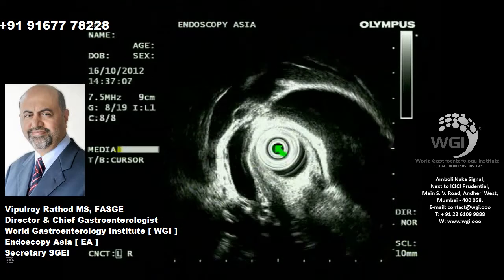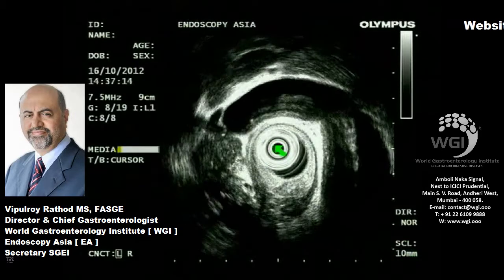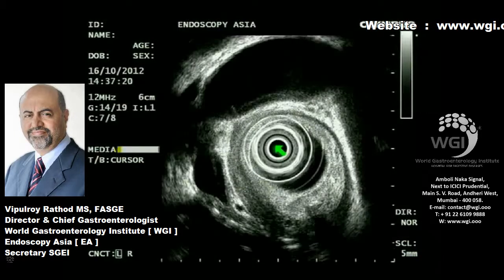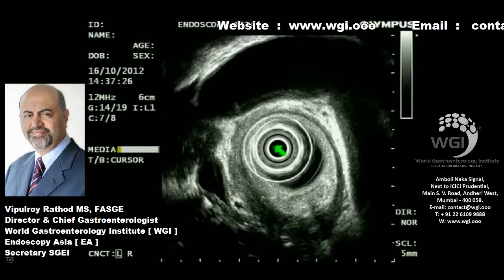This patient does not have obvious cholangitis or cholestasis. There are some reactive nodes, but no obvious mass in the pancreas. And therefore, again, I am evaluating at high frequencies smooth stricture of the bile duct.